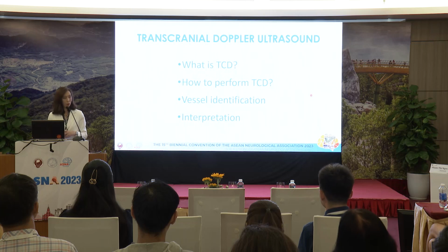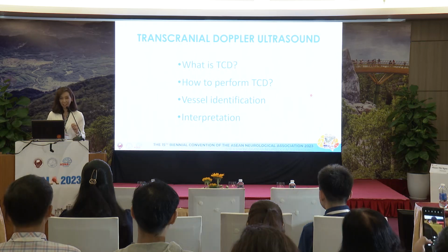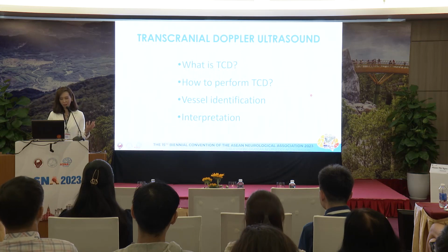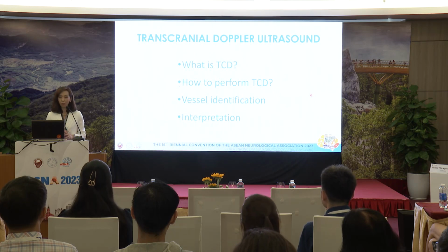Transcranial Doppler or TCD, actually, this is coming back in time a little bit. Dr. Romani talked about TCCD, which is a newer version of TCD. In the old days, we were very used to this blind TCD. It's very convenient. You can carry it around. The machine is quite small. And if you manage to master it, we are very competent that we know what vessels we are looking at.